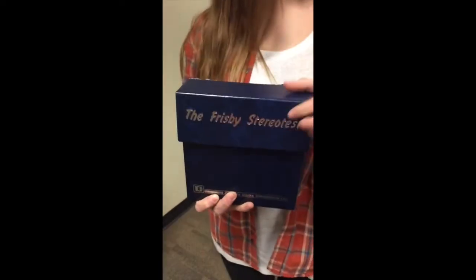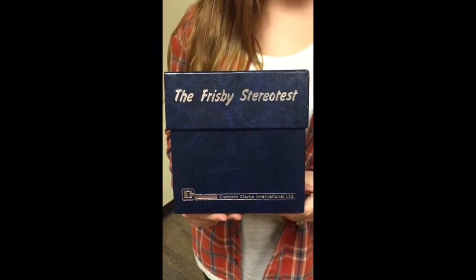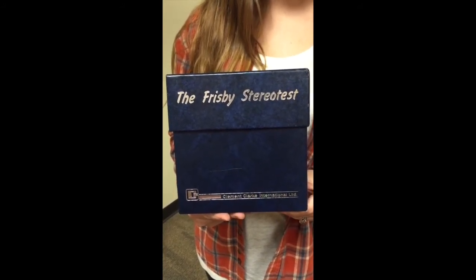This test is useful to us because our Randot test in clinic only measures to 20 seconds of arc, and this measures way farther than 20 seconds of arc. So here we're going to learn how to do it.